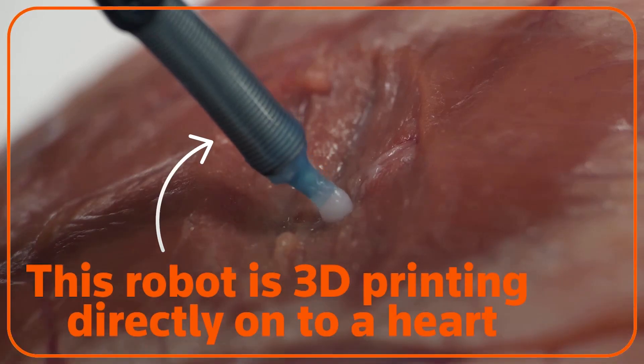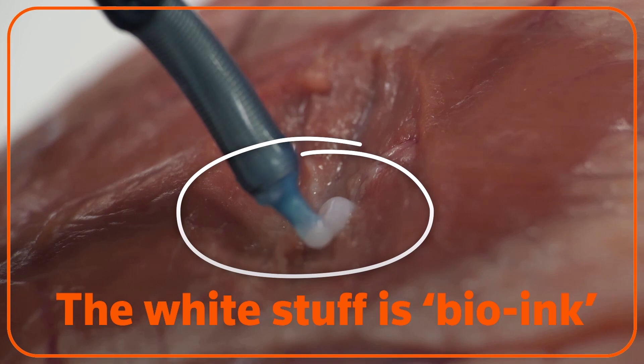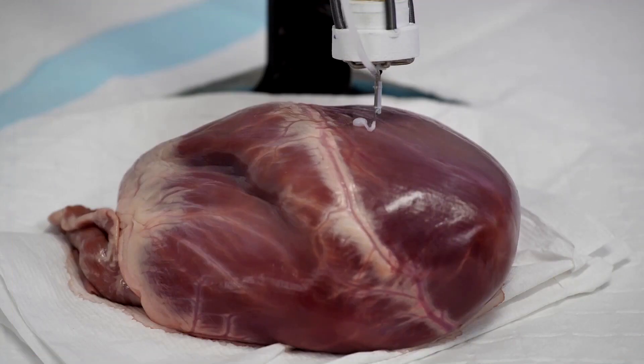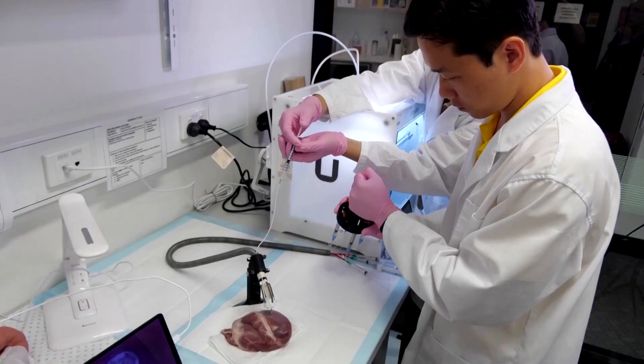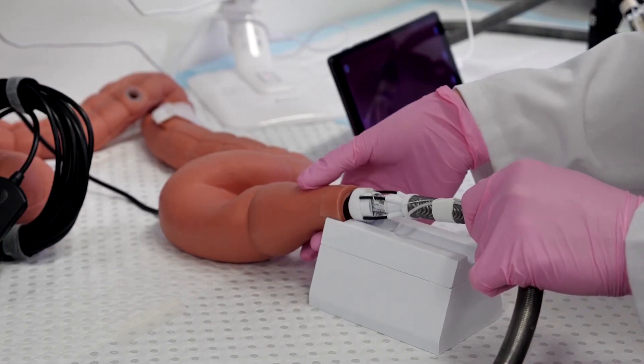This robot is 3D printing directly onto a heart. The white stuff is bio-ink, which can repair organ or tissue damage or ruptured blood vessels. This robot is so flexible and small that it can enter the human body and make repairs directly inside. It could be a game-changer.